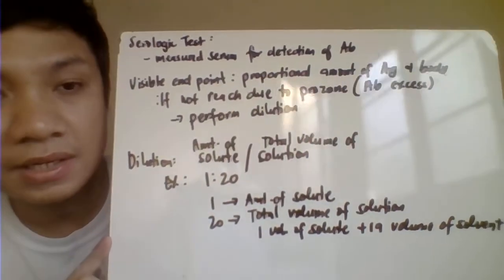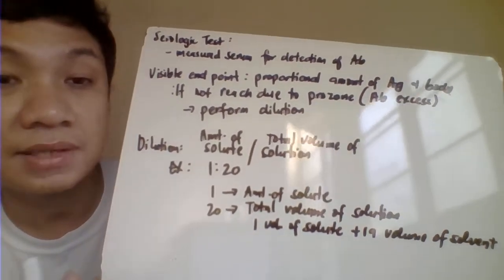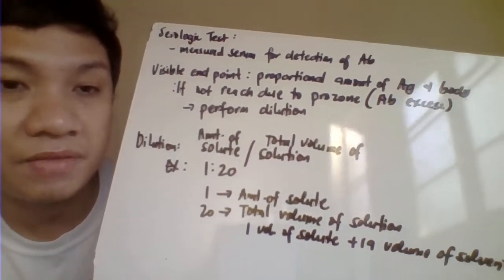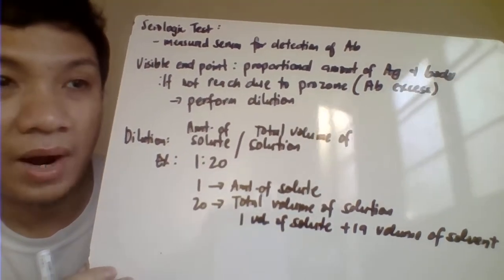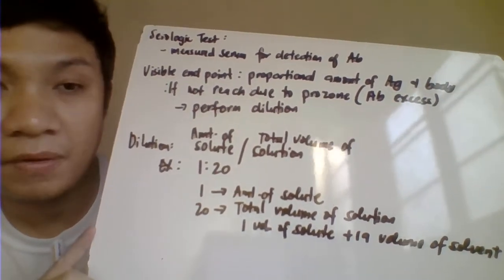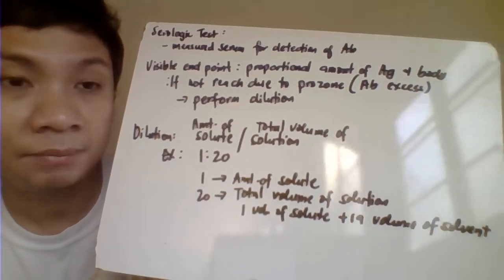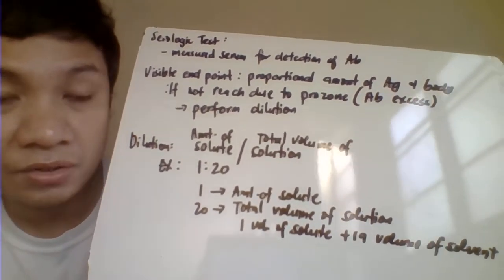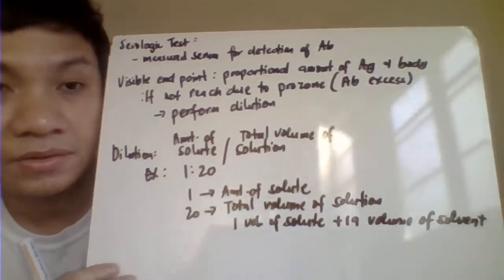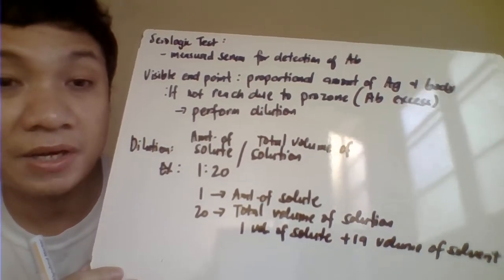The serological testing here is based on the principle of a rise or an increase in our antibody titer. That's why we are determining the reaction with the corresponding antigen as our reagent, a visible reaction, like in the form of an agglutination reaction or any form of endpoint antigen-antibody complex reaction, that is being carried out in our zone of equivalence. This is the zone wherein your antigen and antibody concentrations are equal.